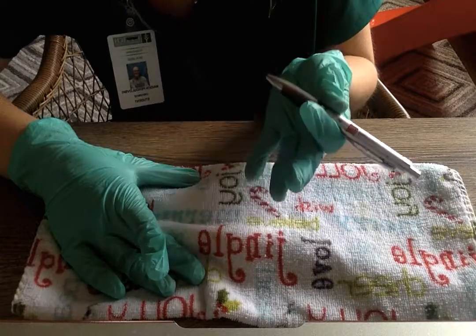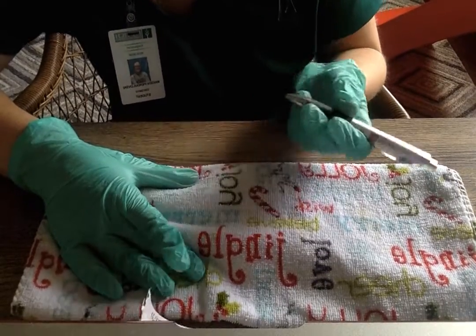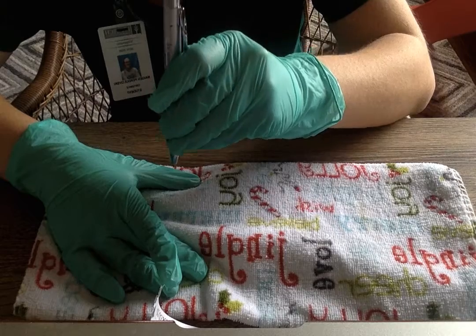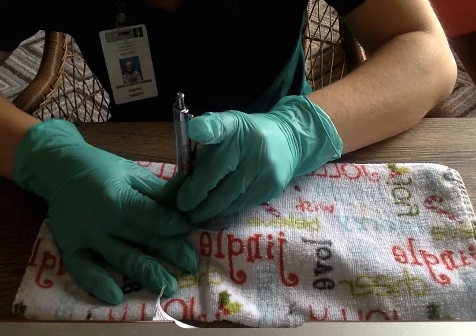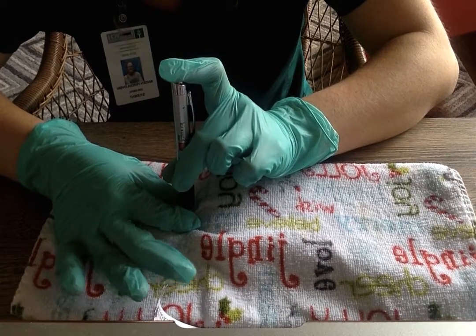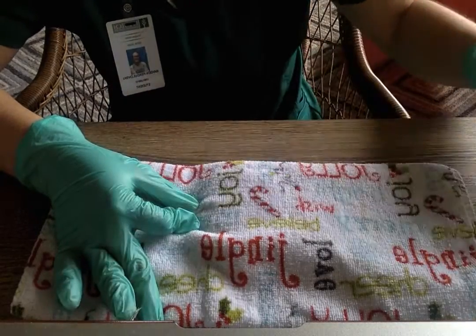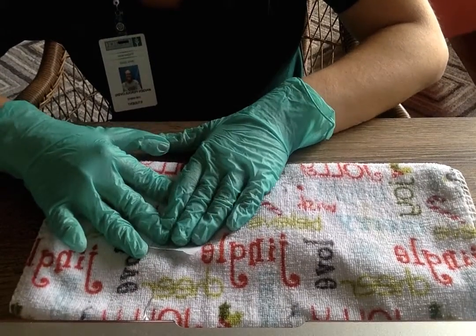My patient is pretty average size, so I'm going to go ahead and pinch about 2 inches, and then I'm going to go at a 90-degree dart, and I'm going to inject, make sure that my needle is nice and secure. Okay, pull it out, get my gauze, apply a little bit of pressure.